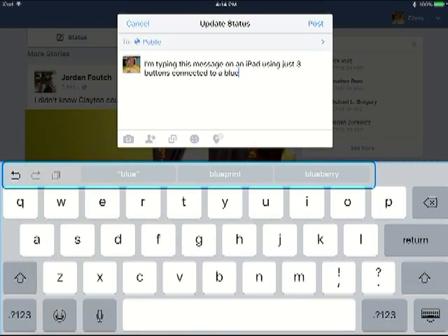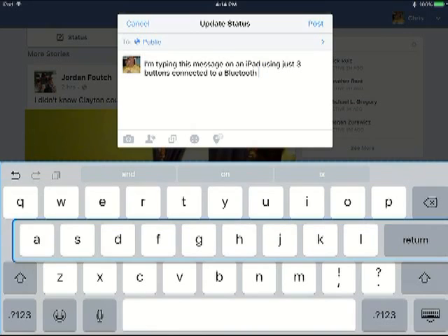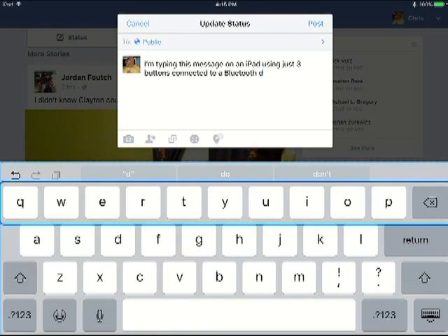When I get my new wheelchair, I may have the ability to do this using the same joystick that I would use to drive instead of using the push buttons. Although I kind of like the push buttons, and I think once I get used to it, it will go even faster.